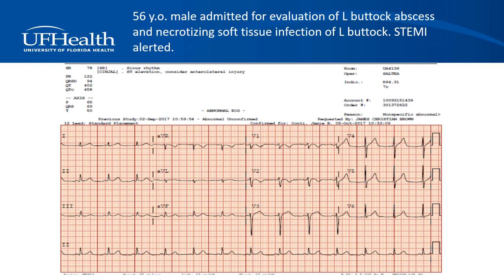Case 7. A 56-year-old male admitted for evaluation of a left buttock abscess and necrotizing soft tissue infection, who was STEMI alerted. Please take time now to review the EKG below.